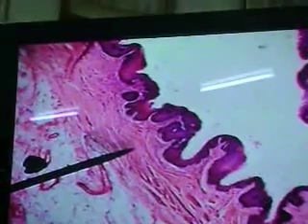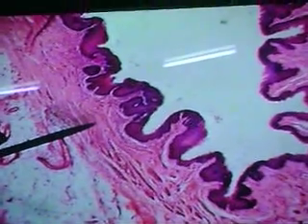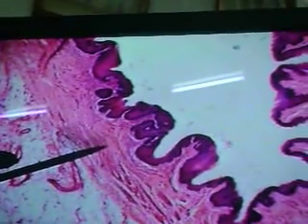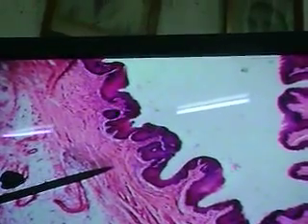There we're seeing a slide now, and what you're looking at right here is a cardio-esophageal junction. Sean, look and see if you have a slide of the lower third of the esophagus. This is the lower third, but it also has the stomach with it. So let me look at this just before. That's the cardio-esophageal junction. You can clearly see.